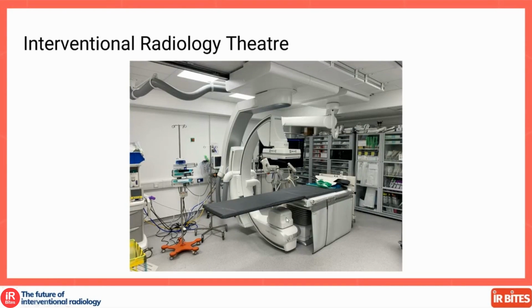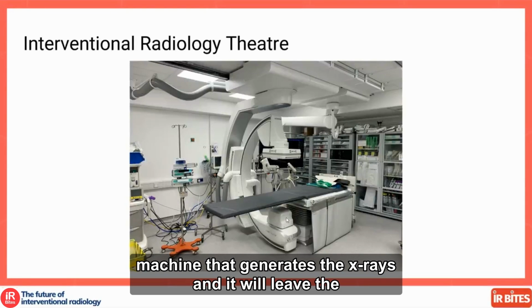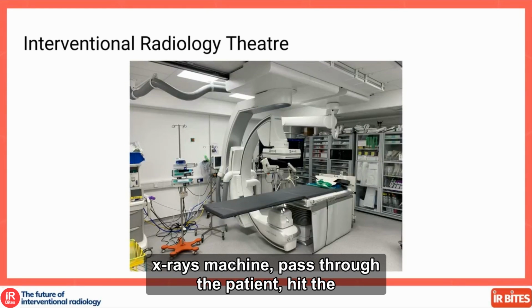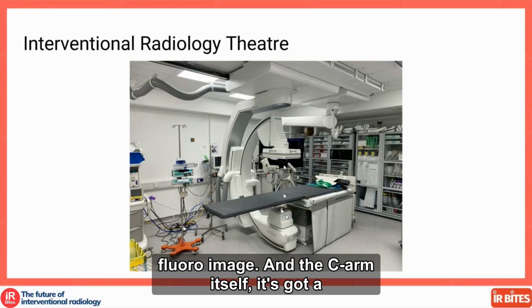And then this is the actual X-ray machine. This is the machine that generates the X-rays, and the X-rays leave the machine, pass through the patient, and hit the detector, and that's how you get the X-ray or the fluoro image.